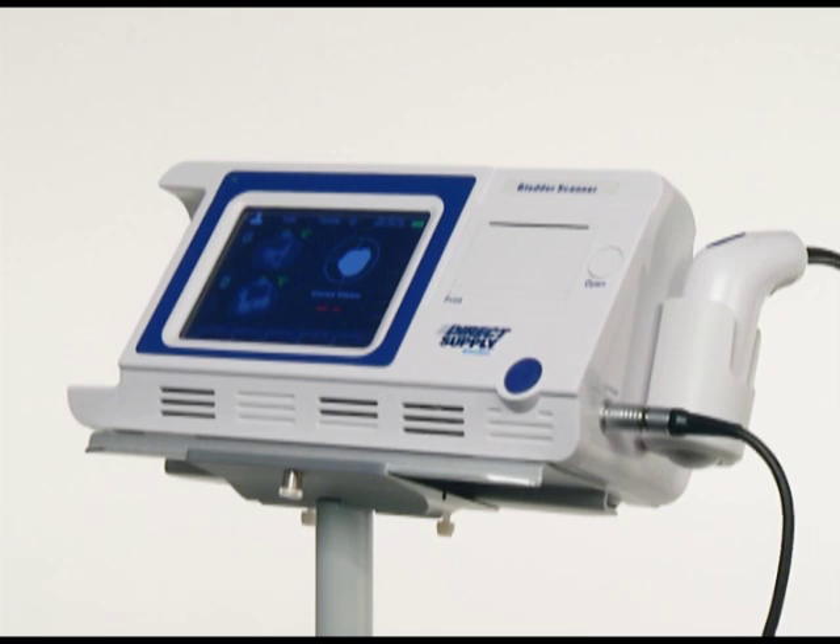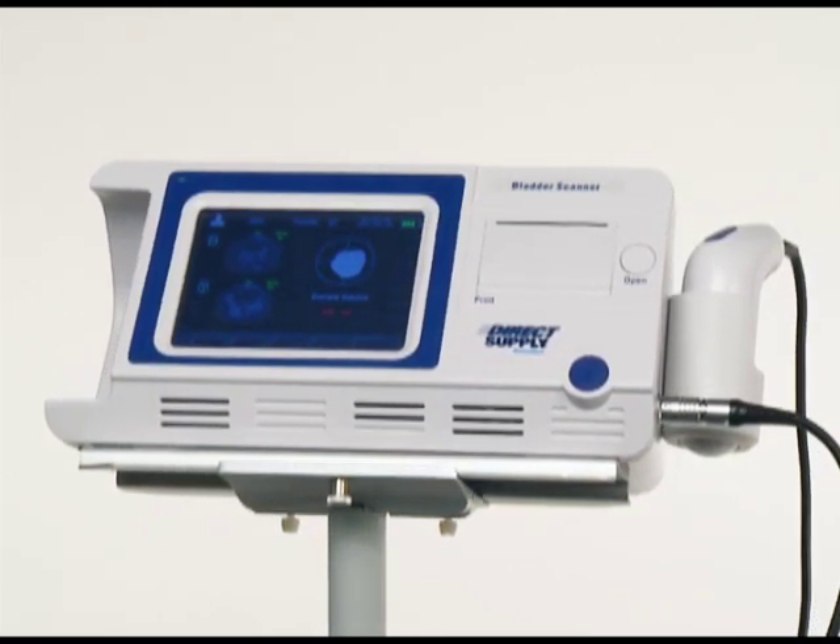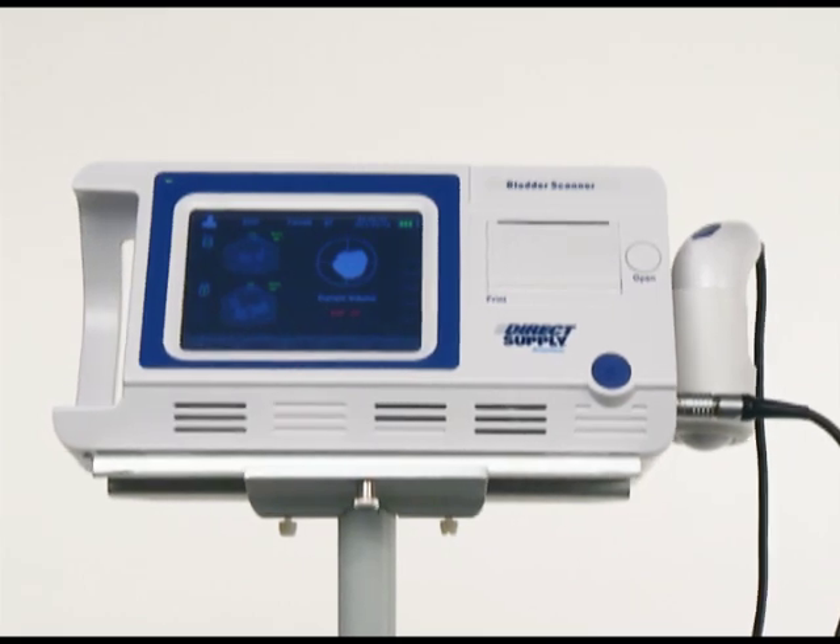The Direct Supply Attendant Bladder Scanner uses ultrasound waves to calculate the fluid volume in the bladder. Here are some tips to help ensure you are obtaining the best possible scan.